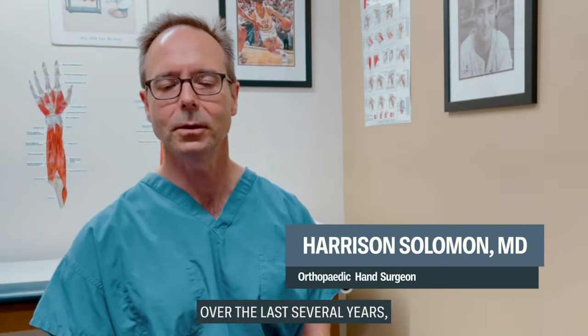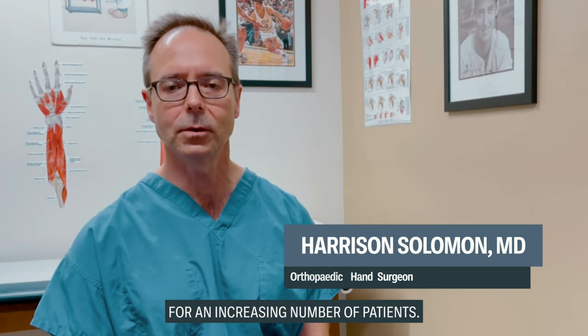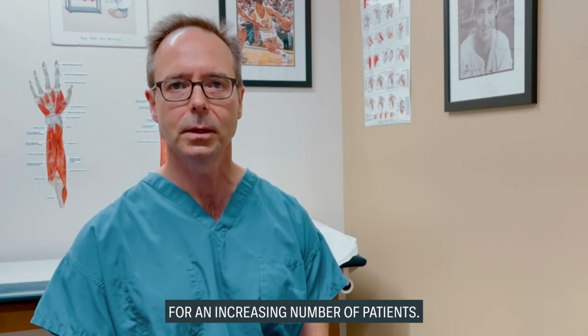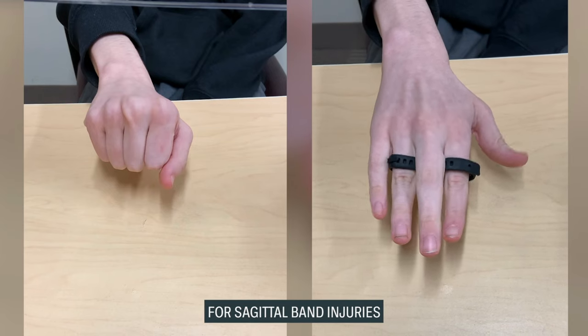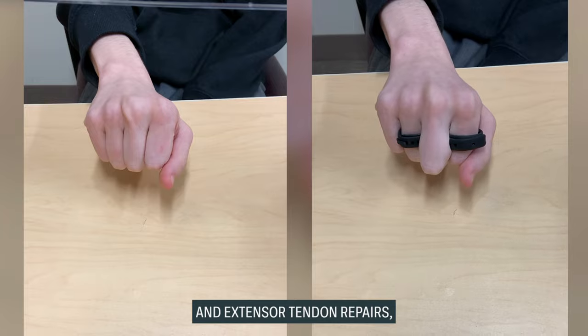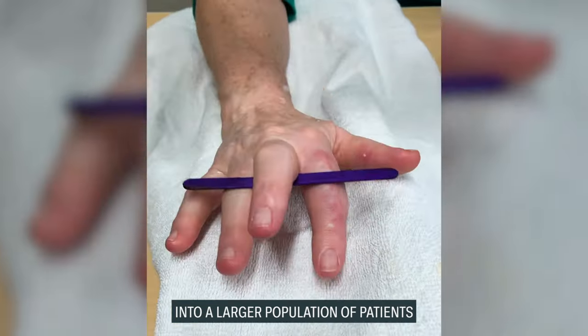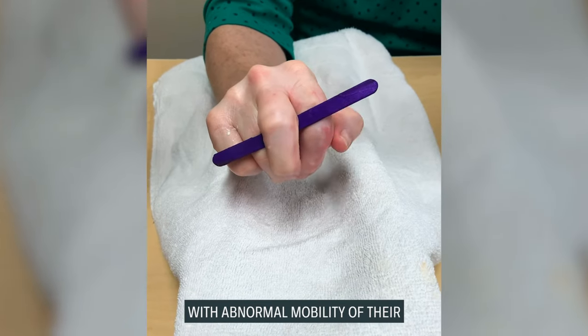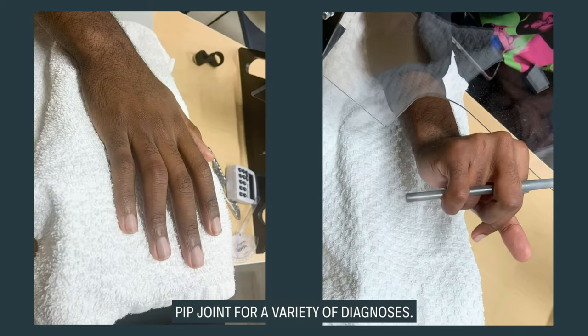Over the last several years we have been using the relative motion orthosis, or yolk splint, for an increasing number of patients. At first we were using this primarily for sagittal band injuries and extensor tendon repairs. However, that has gradually evolved into a larger population of patients with abnormal mobility of their PIP joint for a variety of different diagnoses.